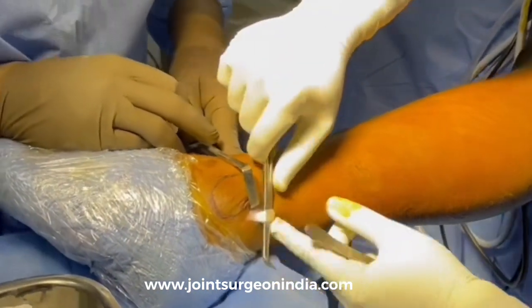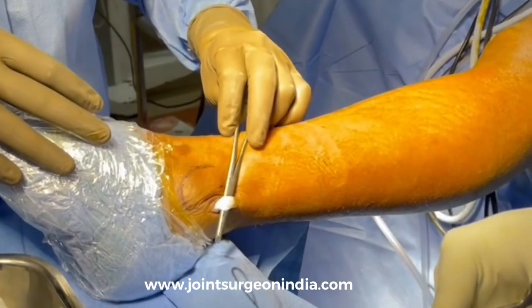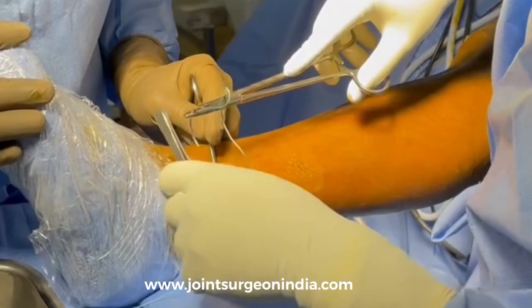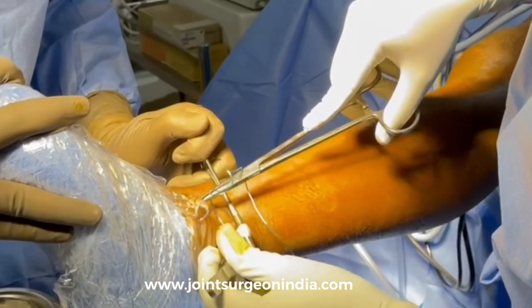The Peroneus longus tendon will be devoid of any muscular attachments near its insertion, whereas the Peroneus brevis would be much more muscular. Once the Peroneus longus tendon is identified, it is pulled using the mosquito forceps, and with dorsiflexion of the ankle, a little more exposure at the distal end is achieved.